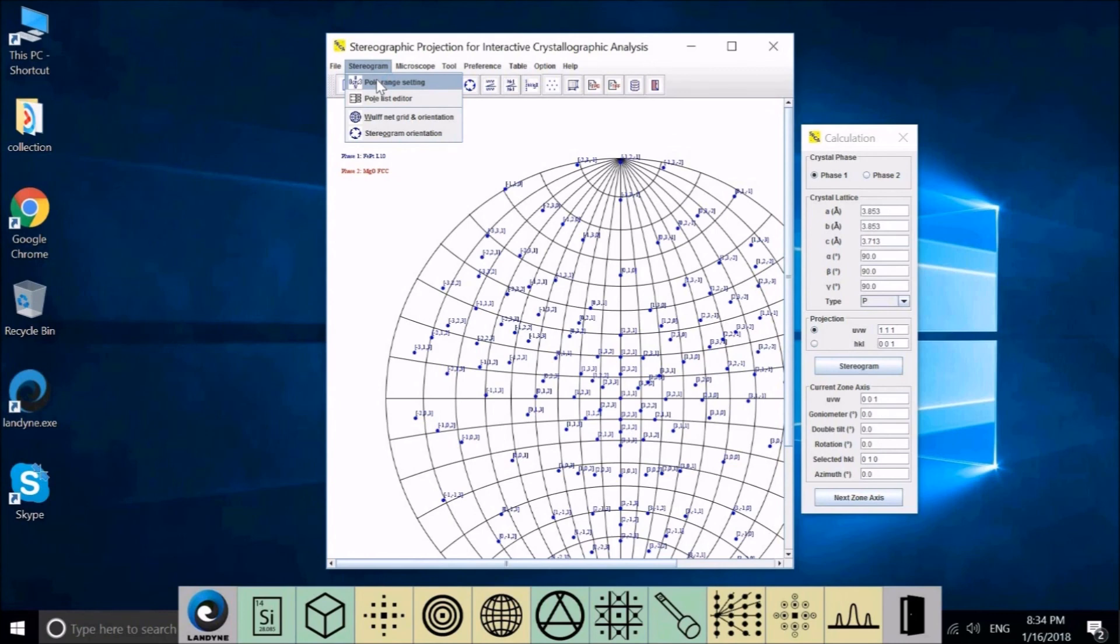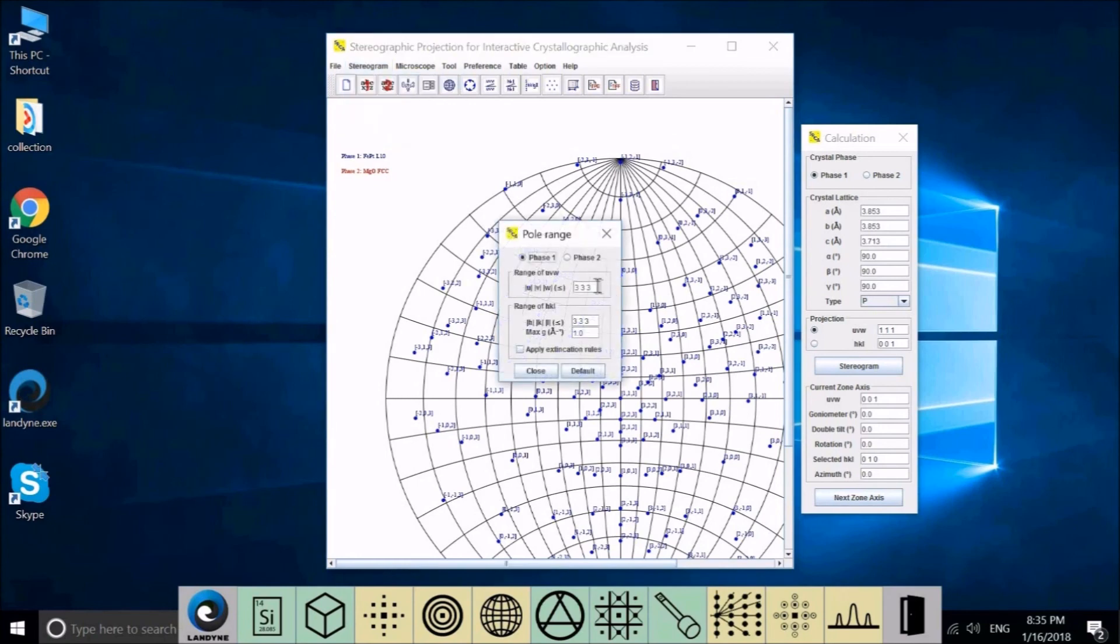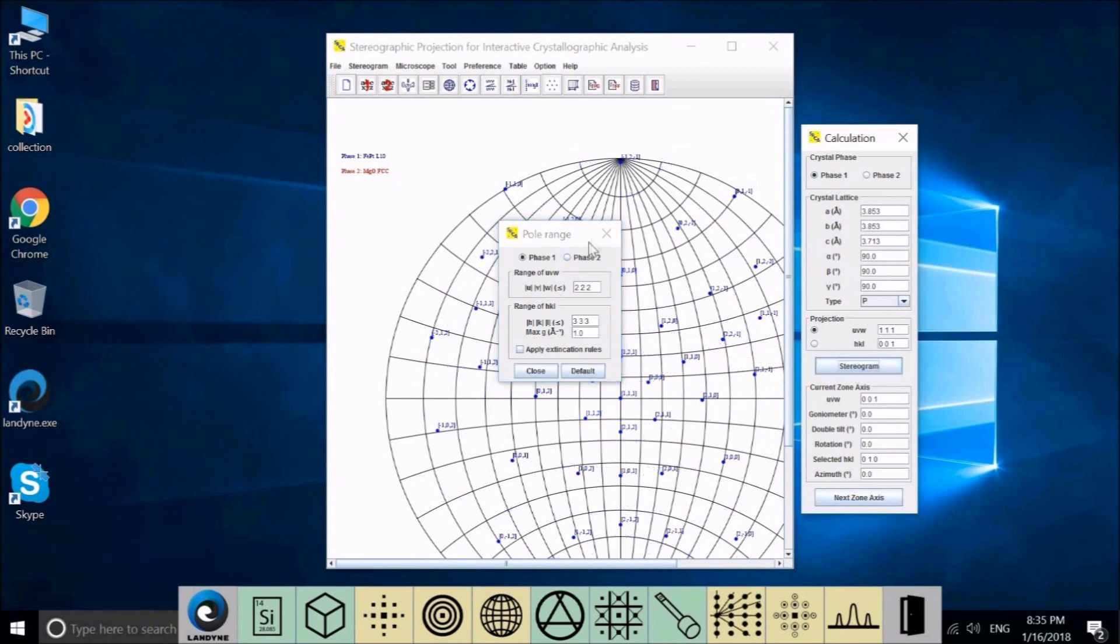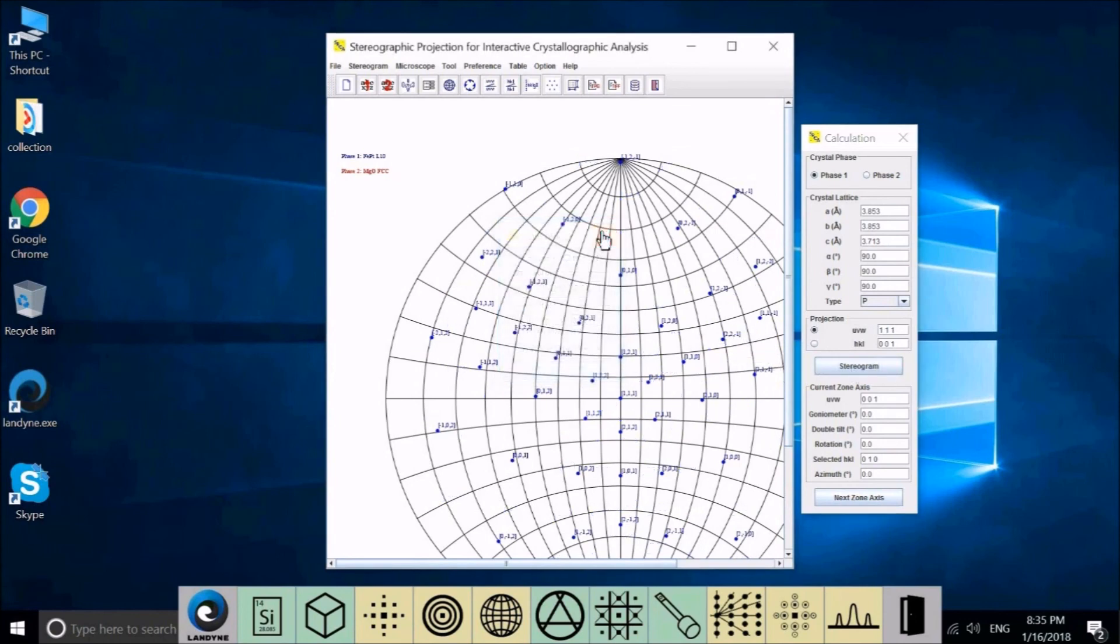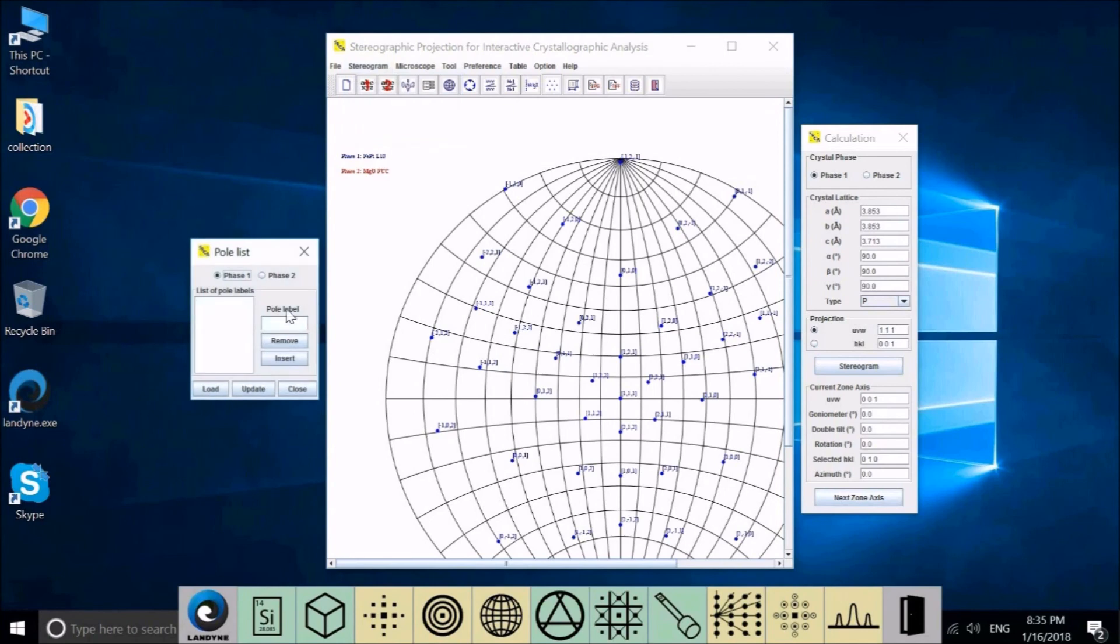The same thing will happen to the reflections. We can control the density of the poles by using the pole range setting. But there are chances that we want to add an individual pole or remove individual pole here without affecting the others. Then we have to use the pole list editor.